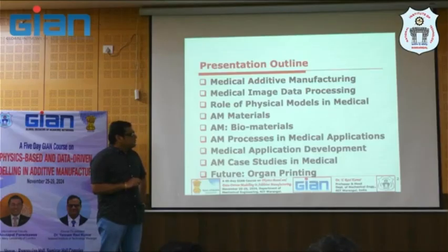As we know, additive manufacturing needs digital data. Digital data in medicine, thanks to computers, means you have CT and MRI data. Medical image processing is now digital, and that is the starting point of your medical application of additive manufacturing. You may have CT, MRI, ultrasound or PET data, any scanning modality. DICOM is the one neutral file format, so you can get these medical images in DICOM form.